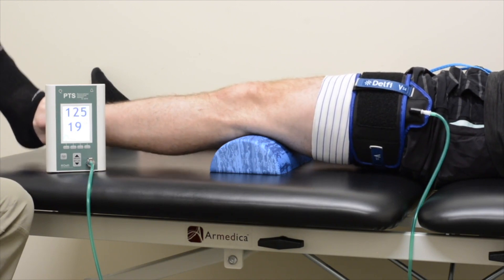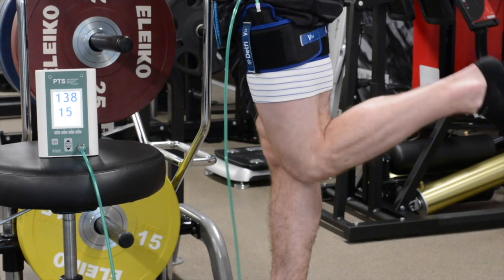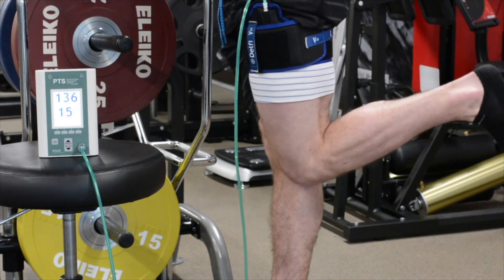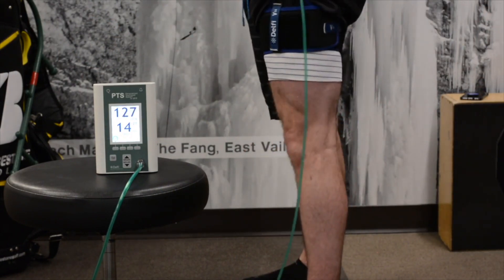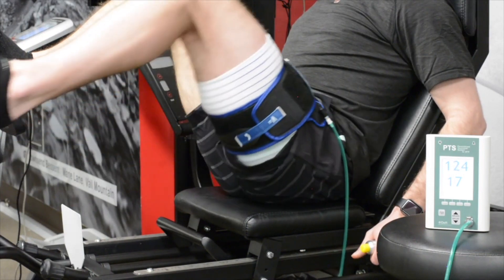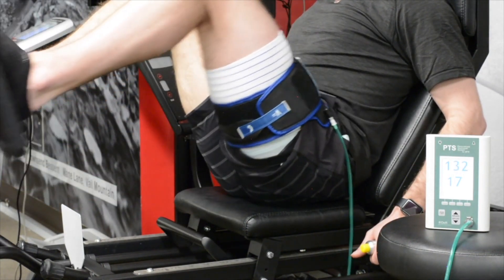Patients should transition from low load activity exercises during the restricted weight bearing phase — when they are at an elevated risk of muscle atrophy — to building muscle strength through bodyweight closed kinetic chain exercises once cleared through to weight bearing protocols. Exercise volume, including the number of sets and repetitions, should focus on building muscle endurance utilizing a high number of repetitions and short rest periods between sets. Once sufficient strength and hypertrophy gains have been made, the clinician can discontinue BFR use for the development of muscular power.